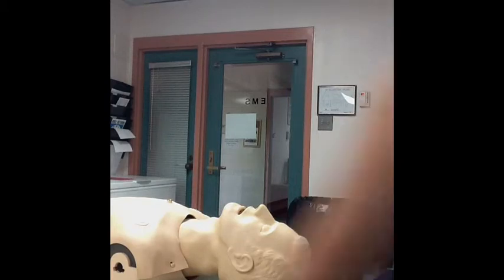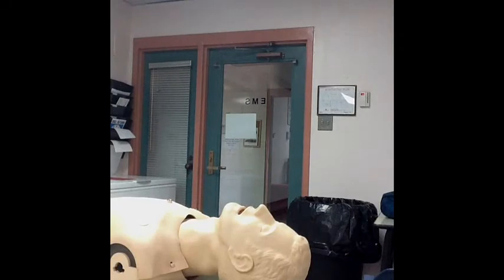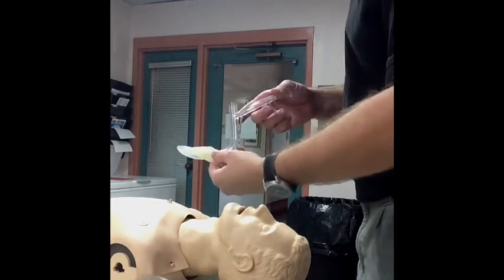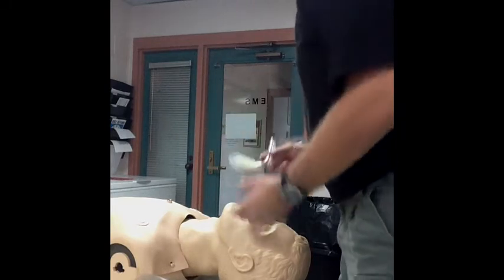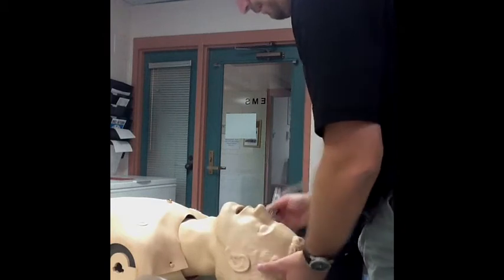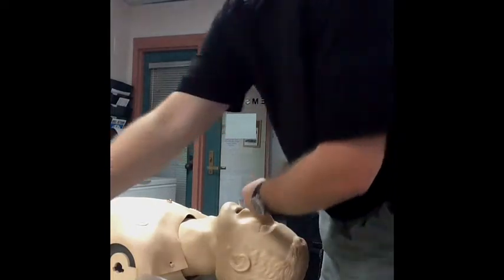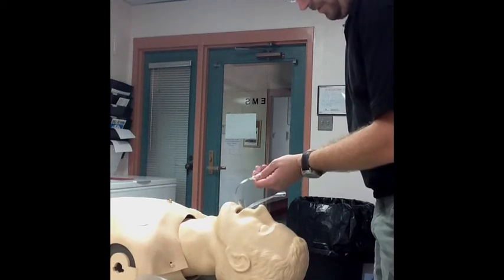We're going to go ahead and demonstrate inserting the LMA Fast Track, the Intubating Laryngeal Mask Airway. Let me grab a bag valve mask device — this is actually a pediatric bag valve mask, so it's a little smaller than adult, but it'll work for demonstration purposes. I'll lubricate the distal end, check all my equipment, position the patient, insert the LMA blindly, and then inflate. This is a size 3, so I'll put about 15 to 20 milliliters of air in.